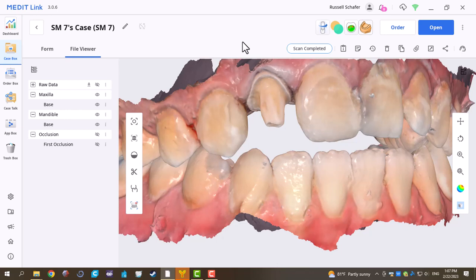But she needed number 7 back today. So I want to go through my process for how we did it. We numbed her up good and fixed 6 and 8 just because they're proximal. I packed cord because I like packing cord for these cases. I've really gotten back into that lately. And what we did with her was I prepped the tooth slightly there. Nothing really, just had to smooth things out a little bit.